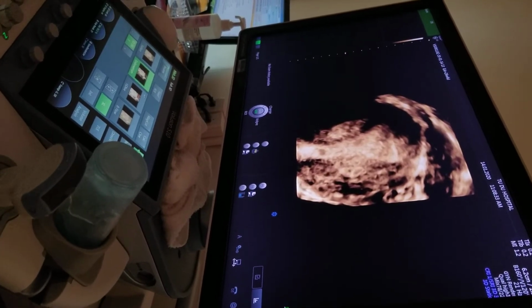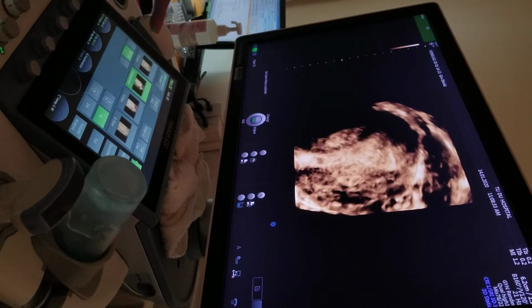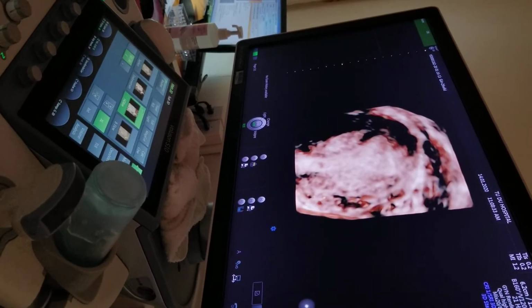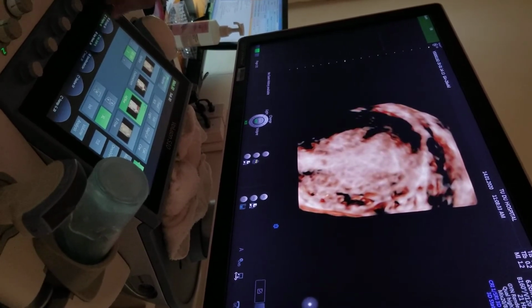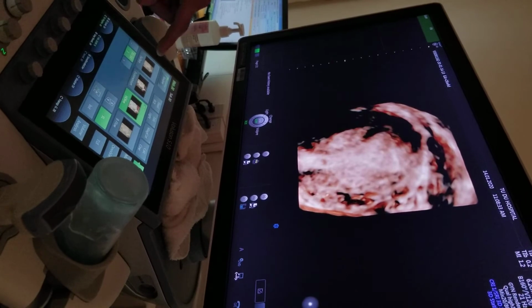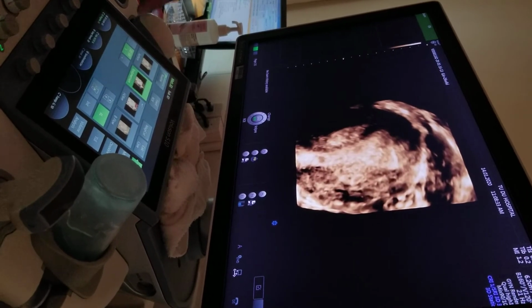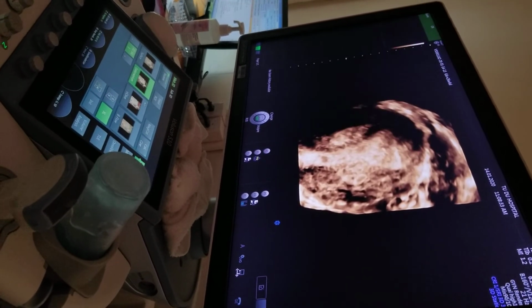You can make it brighter and smaller, and then you can change. You see here different options. So we can go to Sono Life. Wow. You see, and you can change the difference that you want. Okay. And surface, endometrium. Different. Yeah, different. And really clearly. Yeah. Endometrium and serosa, so it's perfectly normal.